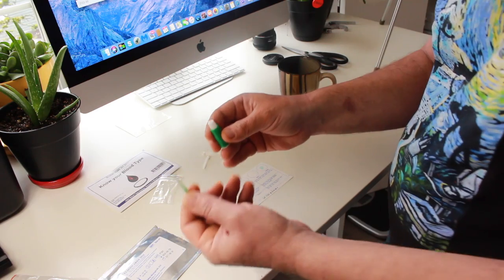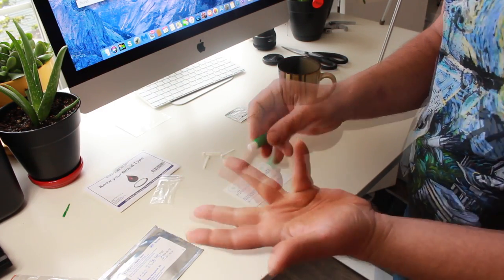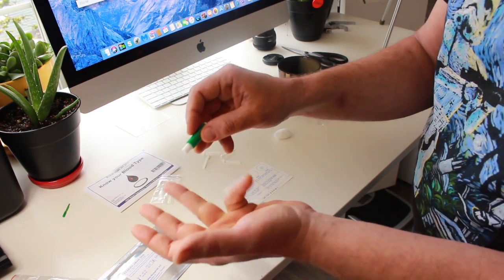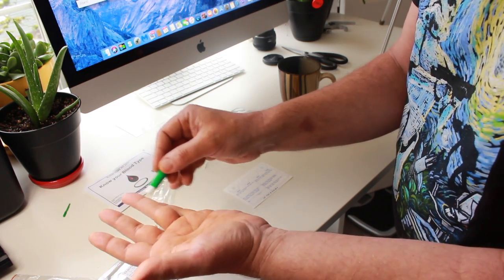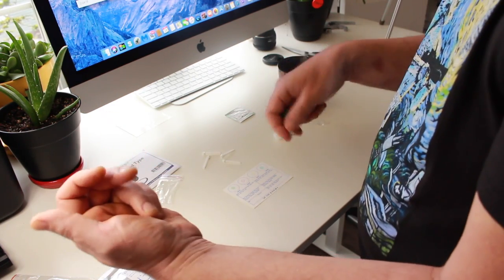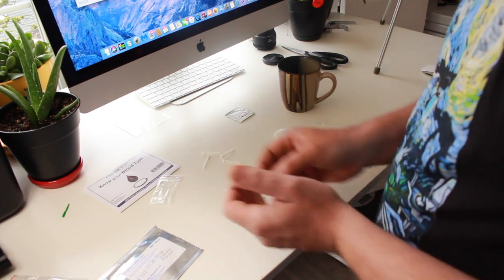Okay, I've removed the safety on it. I had to twist and pull. The finger you're supposed to use is either your middle finger or your ring finger, on the side closest to your pinky. That's what it says in the instructions. I guess this is the side that's gonna bleed the most, they think. Thinking of playing guitar, what finger would be the best? Maybe my ring finger. I think I'm gonna do my ring finger.